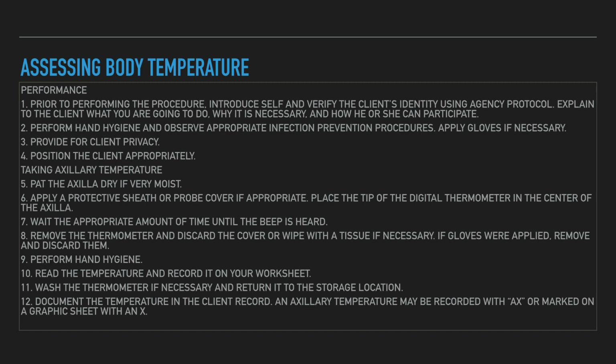Performance. First, explain to the client what you are going to do, why it is necessary, and how the client can cooperate. Discuss how the results will be used in planning further care or treatments. Then, wash hands and follow appropriate infection control procedure. Don gloves if performing a rectal temperature. Next, provide for client privacy. Then, place the client in appropriate position, for example, lateral or Sims position for inserting a rectal thermometer.